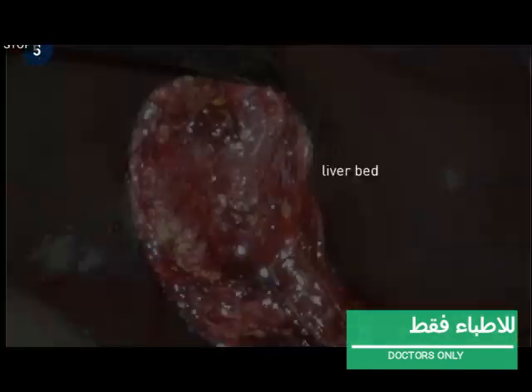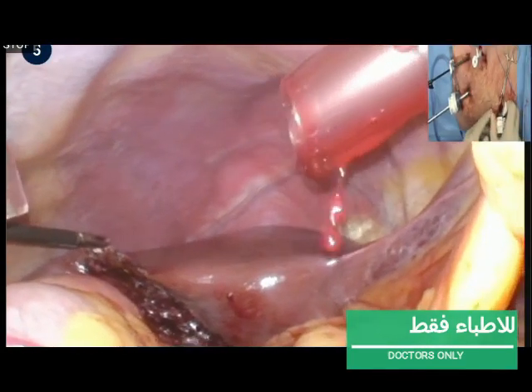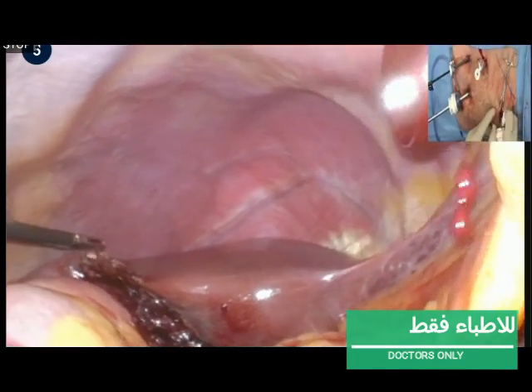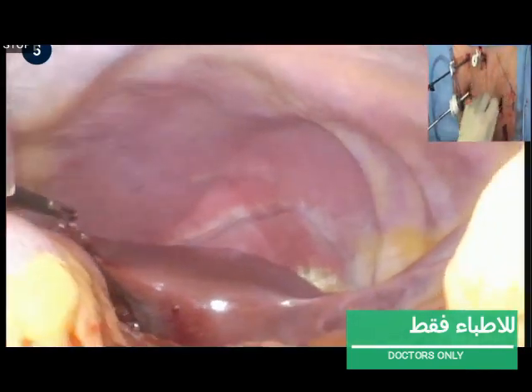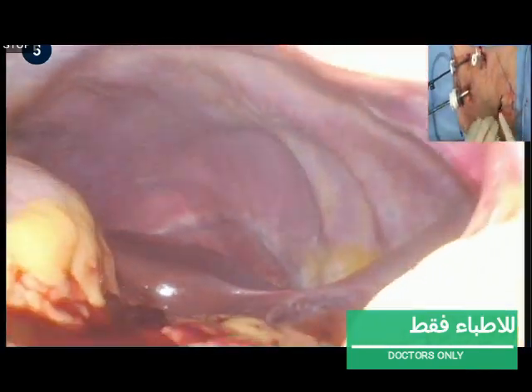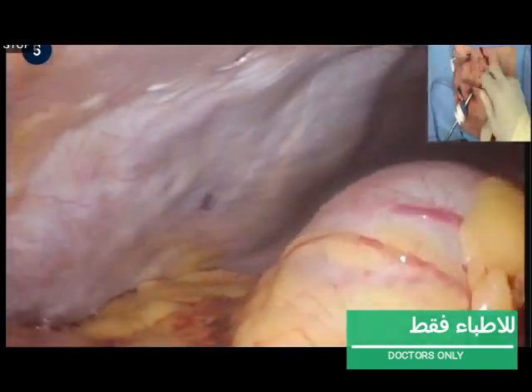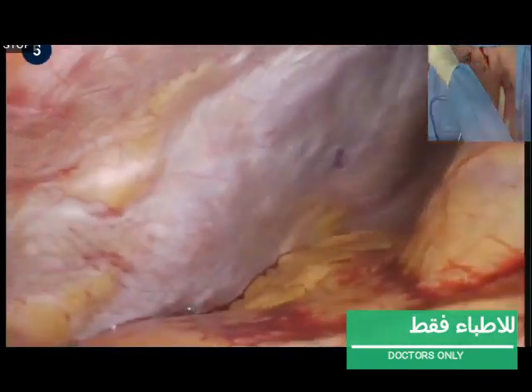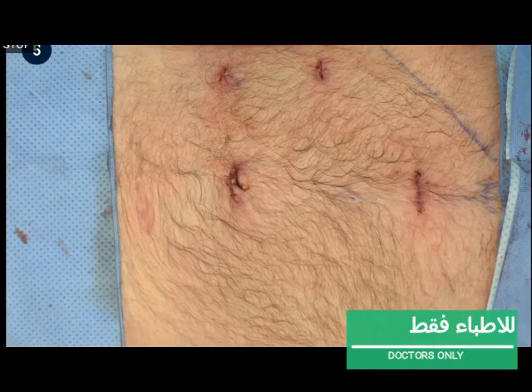The dissection plane of the liver bed is inspected for bleeding. The instruments and the trocar are removed under camera guidance. The fascia of the 12 mm wounds and the skin are closed with absorbable sutures.